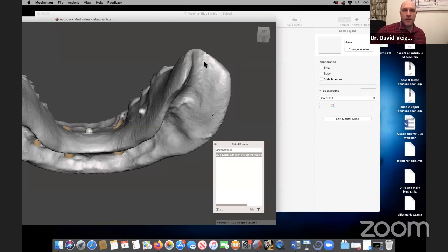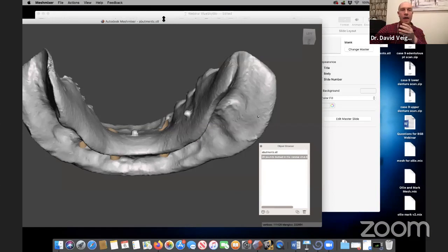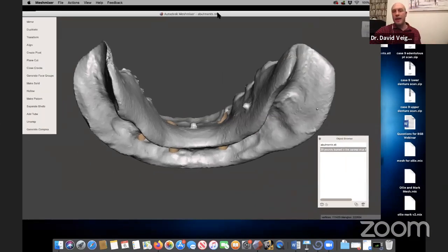Do you use hexed multi-unit abutments, and how do you get the position right once the implant's in place? Yeah, great question again. The majority of my cases, I try to plan parallel, so vertical implants. But obviously bone won't always allow that, and you sometimes have to tilt the distal ones to stay out of anatomical areas.